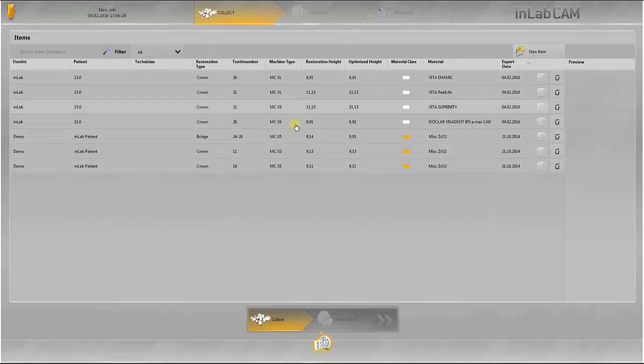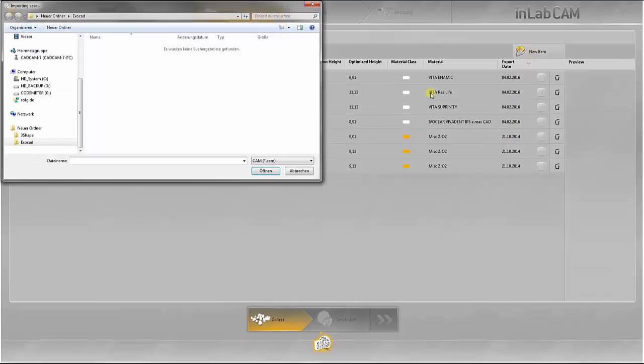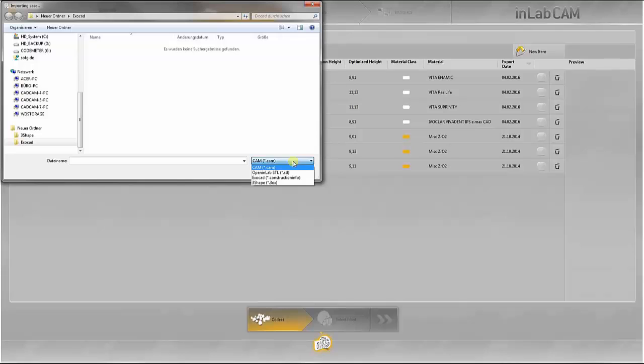In this overview, you see all the design data which has already been loaded in the InLab CAM software. You can access your folders via this button and import STL data, for example from Exocad.